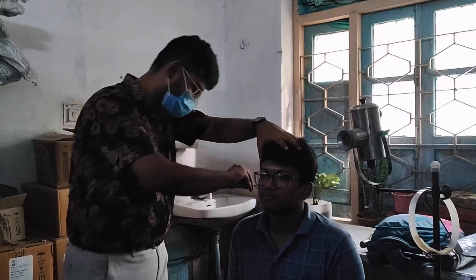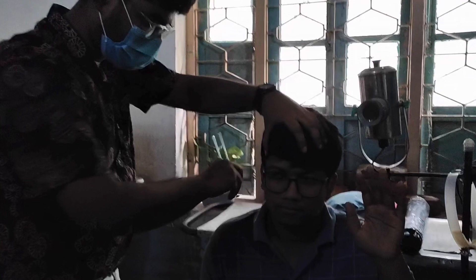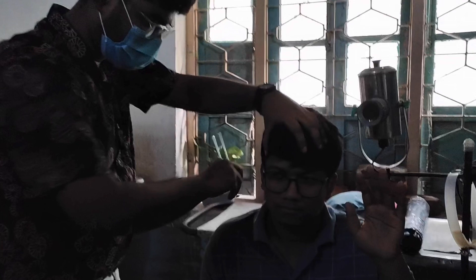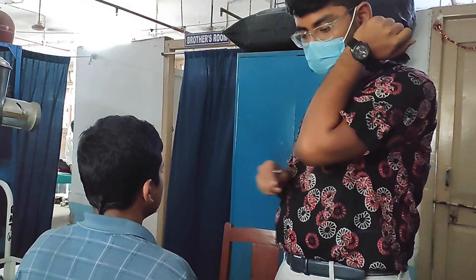Starting with the Rinne's test — first we put the tuning fork into vibration and place it on the patient's mastoid. The patient was previously informed about the procedure, so he was asked to lift his hand at the point when he can no longer hear the vibrations from the mastoid. Since he has lifted his arm, we now bring that vibrating tuning fork near the external auditory canal. The placement of the tuning fork should be like that.